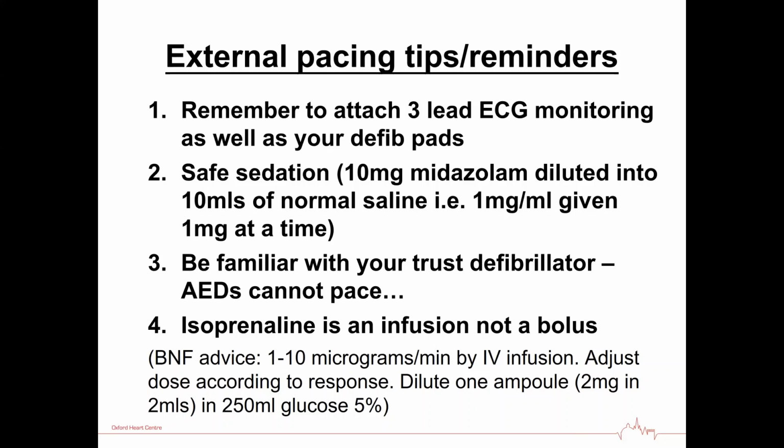So a few tips really to talk through about external pacing, and the key there, and you hear me mention it, is that make sure you've got your 3 leads monitoring attached as well as your pads. And that's the commonest reason in a stressful situation that people put the pads on and they can't pace. It's because they haven't put the 3-lead ECG monitoring from the defibrillator, not from the bedside monitor.